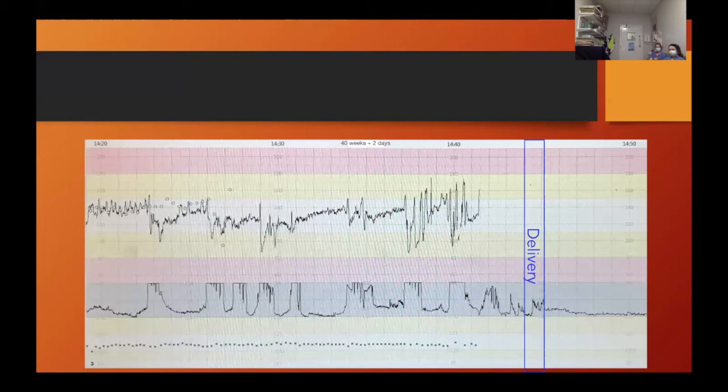Okay. So the main purpose of this was obviously how to present, how do we describe traces. Okay, we're going to be talking about the guidelines. So we're changing the hospital policy because we are adding in the new STAN guidelines, and we're making a decision tree that's supposed to help. I think Gabby and Vanessa would have talked to you at induction about this. Okay, so we're going to enforce this with our teaching and how we're going to be presenting this. Does that make sense?